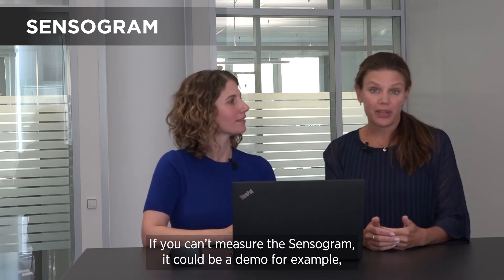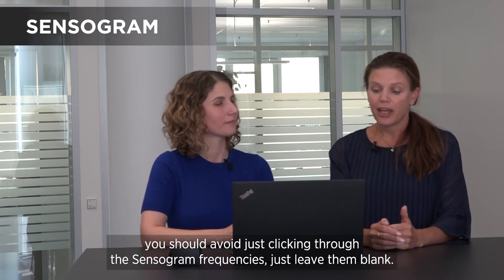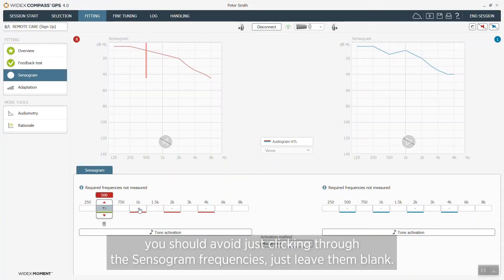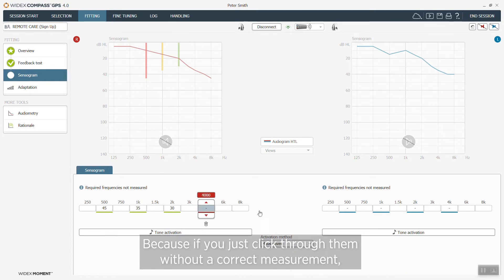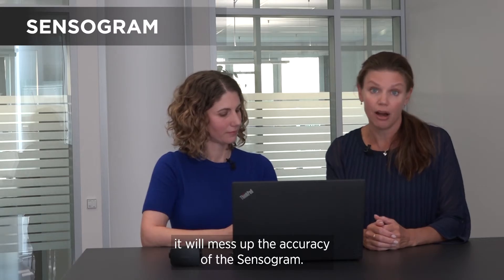So if for some reason you can't measure a sensorgram — it could be for a demo, for example — then you should avoid just clicking through the sensorgram thresholds. Just leave them blank, because if you click through them without a correct measurement you will mess up the accuracy of the sensorgram.